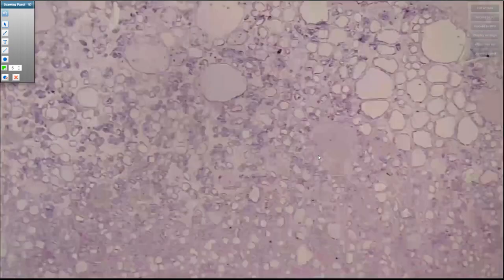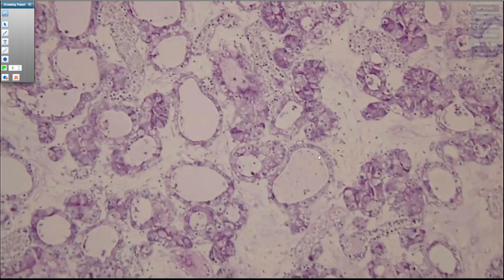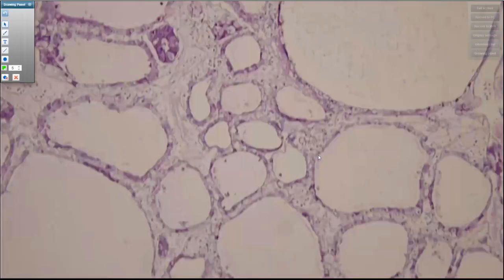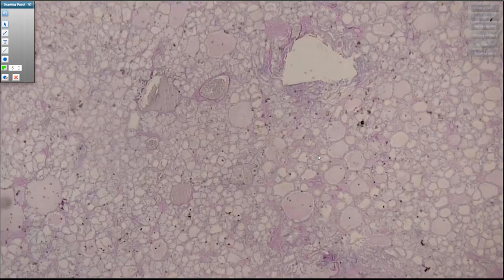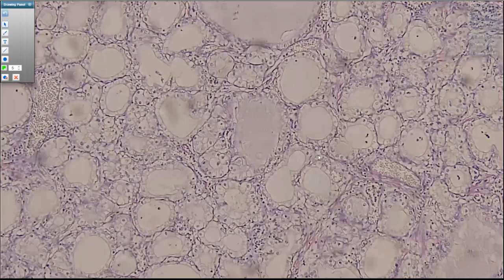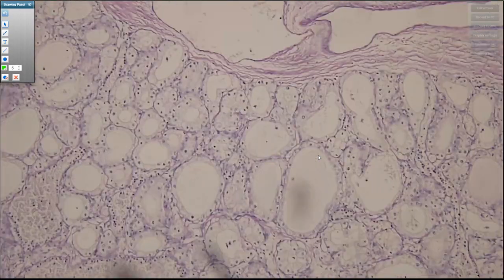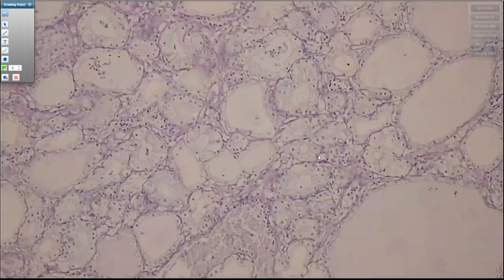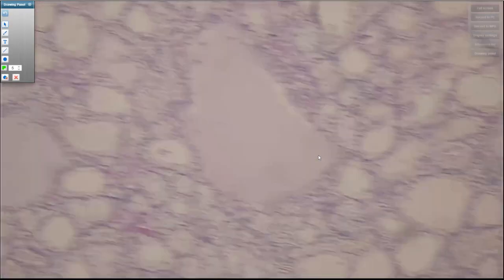So because the cytoplasm is clear, you can ask, well, why is it clear? What's in there? It's actually glycogen, which can be a helpful trick. So if you were ever confused, you can do a PAS, and the PAS will beautifully highlight that glycogenated cytoplasm, the bright pink. And since it is glycogen, if you do a PASD, or a PAS with diastase, the glycogen will dissolve, and this is a PASD. And so here you no longer have that pink positivity, again confirming this was serous lining that had glycogen, which was what was creating that nice clear appearance. So again, no pink staining on that PASD.